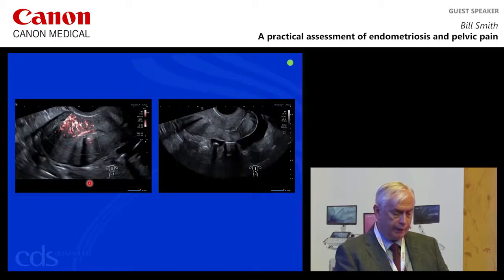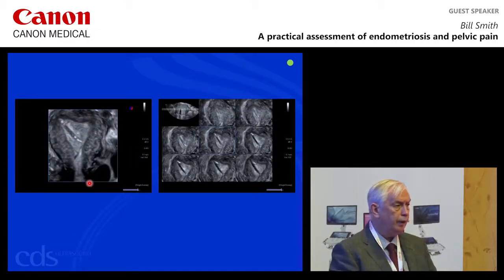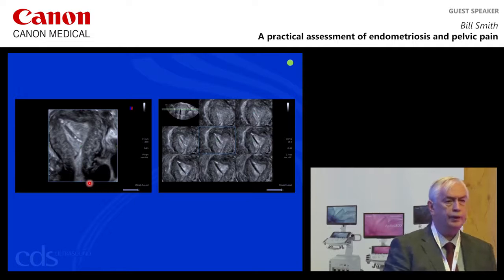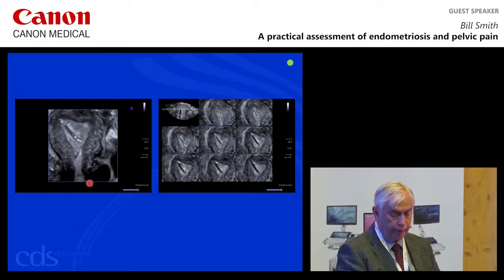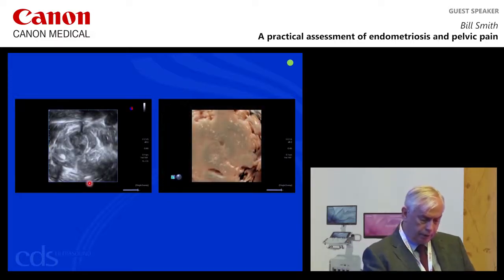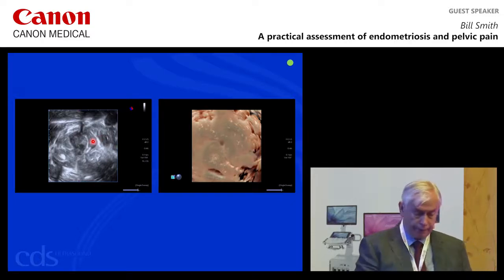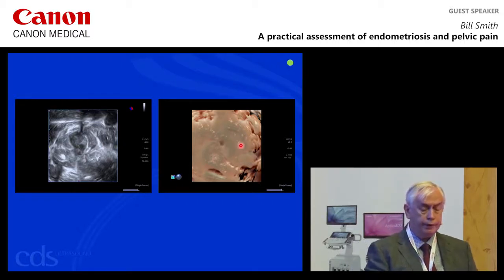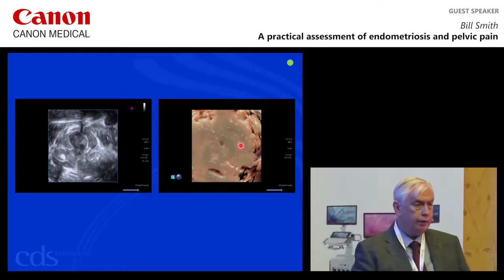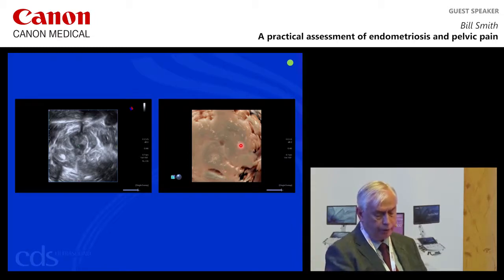And if we take this case here, again, it's pelvic infection. We have the complication of a coil there. We're not quite sure what that Mirena coil is doing. It seems to be twisted and heading towards the right interstitial tube. And just in the corner there, we have a pyosalpinx. And the ovary is here, the pyosalpinx is there on our shadow glass image. So they are causes of pelvic pain emanating from the uterus.